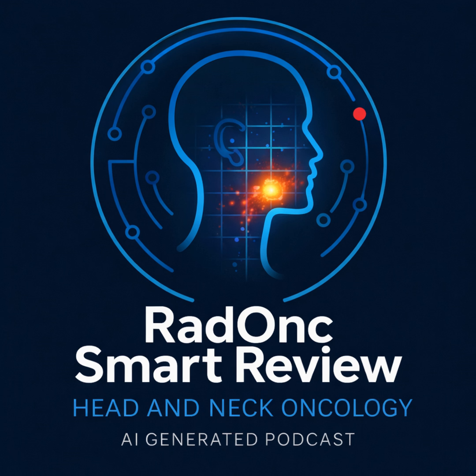It is good to be back. This is episode 32B, Hypopharynx Planning Workshop. Now, if you were with us for the last session, episode 32, you know we laid down the foundational laws. We established the rules of the road for the hypopharynx. We covered the 4 absolute defaults, the nodal template, that crucial inferior extent ladder, and our priorities for organs at risk, or OARs.